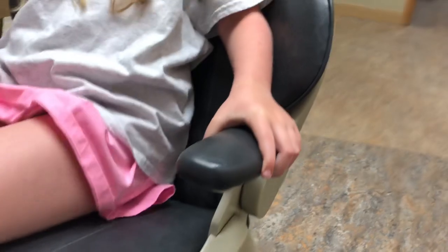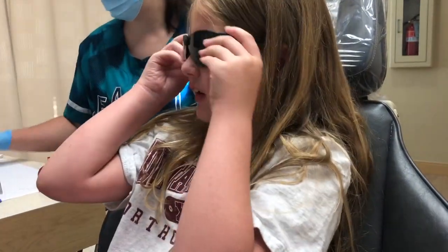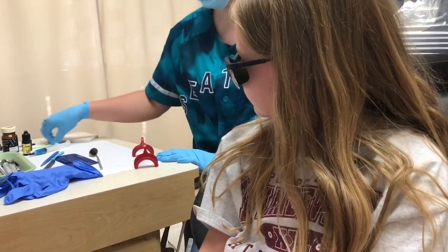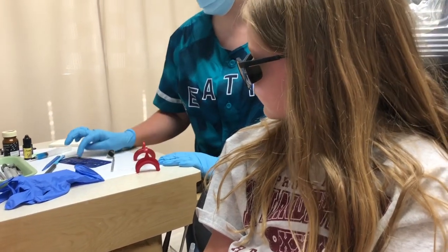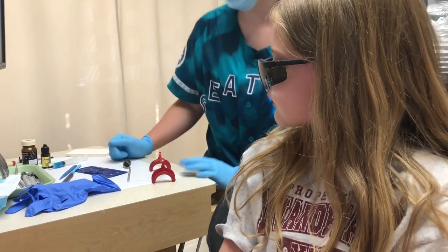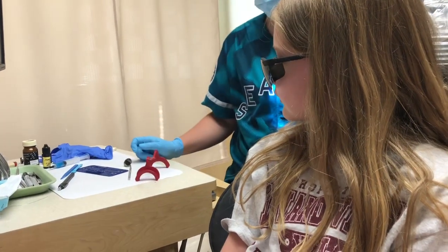So I'm gonna put some cheek retractors in, and then this is blue gel — it's not a shot, just sits on top of your teeth. Then I rinse that off, put a bonding resin on to protect the teeth, just paint that on, blow lots of air, set it up with my light. Then I'm gonna put your braces on one by one, just like stickers. Dr. Gabby will come over and make sure they're in the right spot. After that I shine my light which sets up the glue, then we'll take this out, look at some colors, get your wire in. Pretty easy.